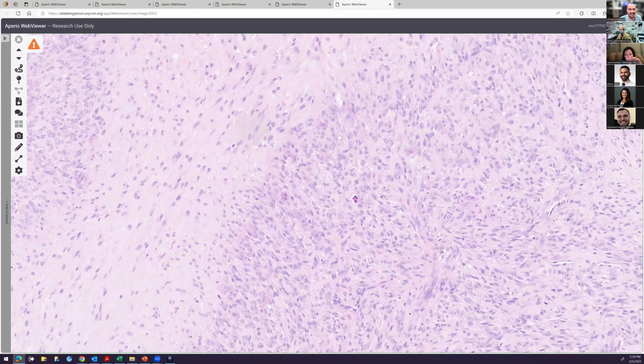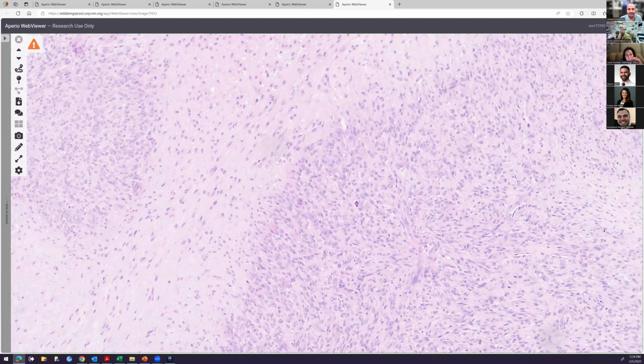I'll tell you it's on the hand, I guess, maybe. It's somewhere on the hand of like a, I don't know, a 15-year-old or 20-year-old. Could these not be calcifications like phosphaturic mesenchymal tumor? But I don't think it would look exactly right, like this.